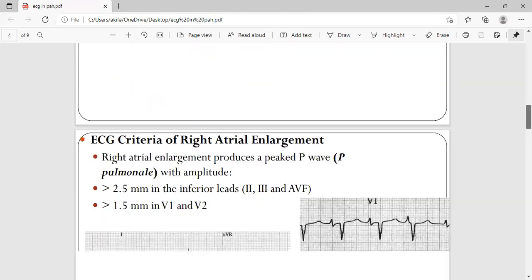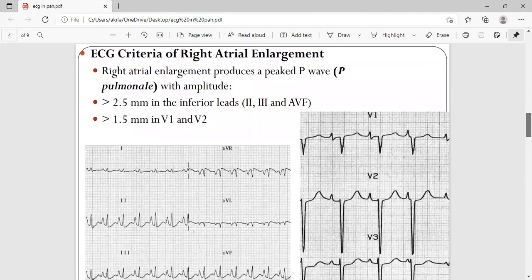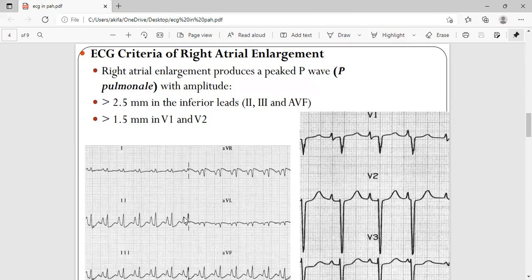There can also be right bundle branch block. Regarding right atrial enlargement: the SA node is present in the right atrium, so it is the first part to contract. When the right atrium enlarges, its depolarization overlaps with the left atrium, producing a peaked P wave. You can see P waves greater than 2.5 mm in the limb leads, or greater than 1.5 mm in V1 and V2 — this is called P pulmonale.